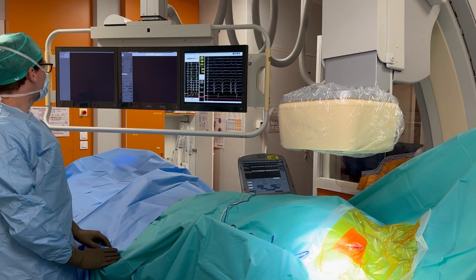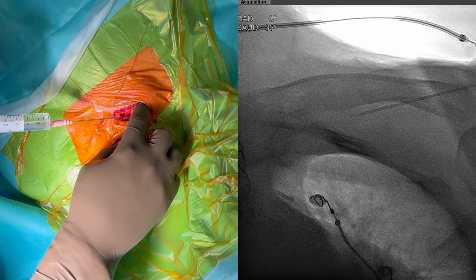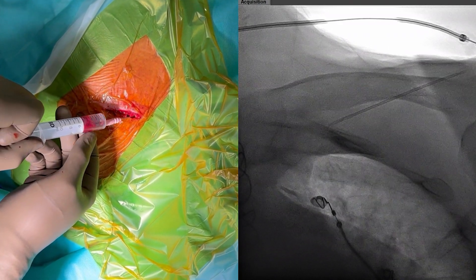After reaching the pectoral fascia we move the fluoroscopy tube to a very caudal angle. The area of interest is a triangle defined by the clavicle and the first rib. As we can clearly see the edge of the ribcage, there is no risk of pneumothorax.